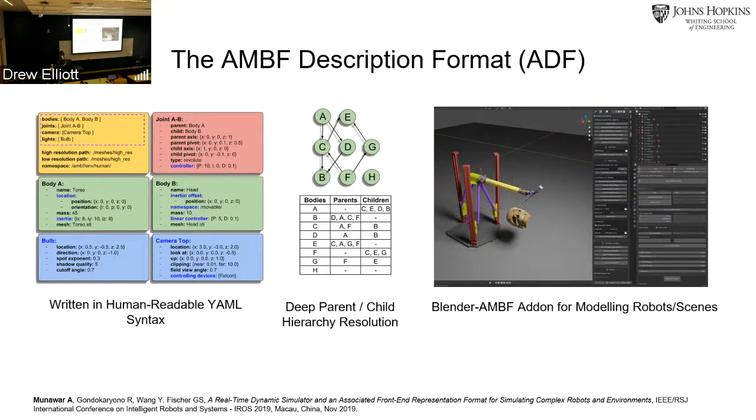And even though AMBF is very simple and very user-friendly to read, it's still another format to learn. So we have created the Blender AMBF add-on so that you don't have to touch a line of the description format and use the GUI 100% to make very complicated environments. And there's a hands-on session for the Blender AMBF add-on later today. To the best of our knowledge, the Blender AMBF add-on is the most feature-rich and advanced tool for making robots and environments for AMBF.